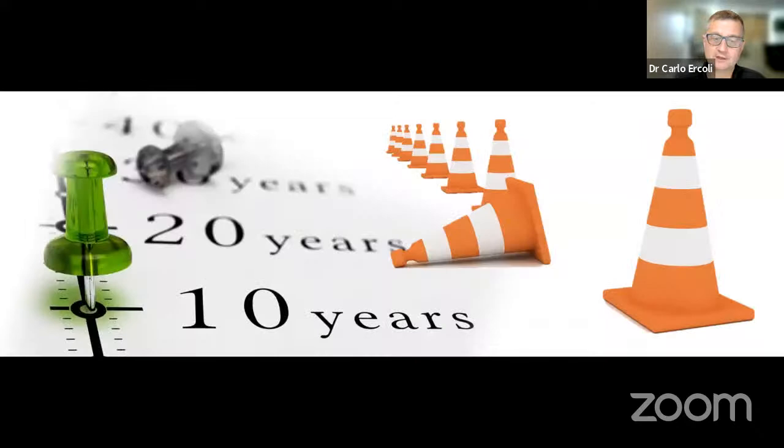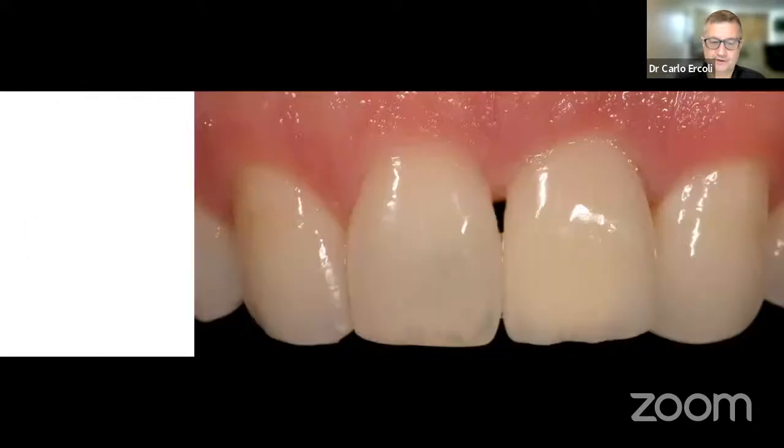So the patient then came back at about 10 years. You can clearly see that the restoration looks great, but the papilla really hasn't grown that much. So here is where the difference between a mean result in a study and the two extremes becomes important. It is true that as you deliver a crown, there is a tendency of that papilla to grow by about 1 millimeter. But again, this happens as a mean. Often, we end up treating patients that might not fit within those mean results, but may be on the extremes. So often, these situations might not turn out correctly.